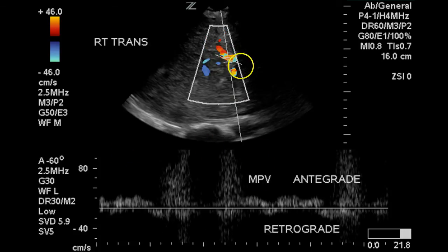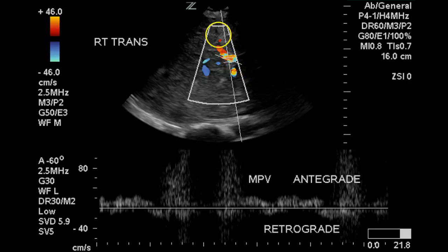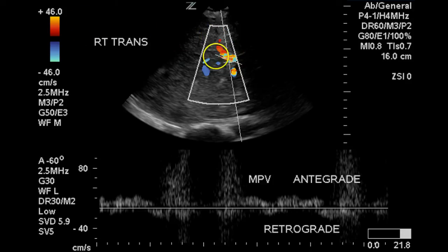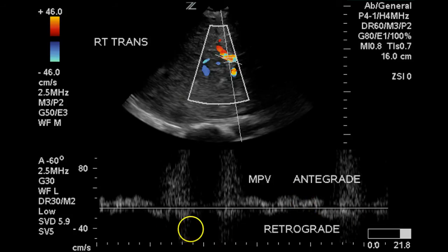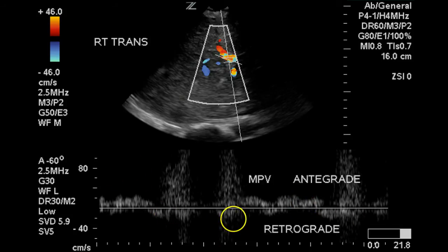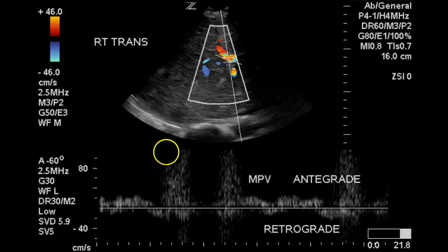Here is some flow in the main portal vein. This is hepatopetal — we can see it flowing red, toward the top of the screen, which is the normal direction. There are some areas where there is retrograde flow as well, so we are getting some reverse flow in the main portal vein.